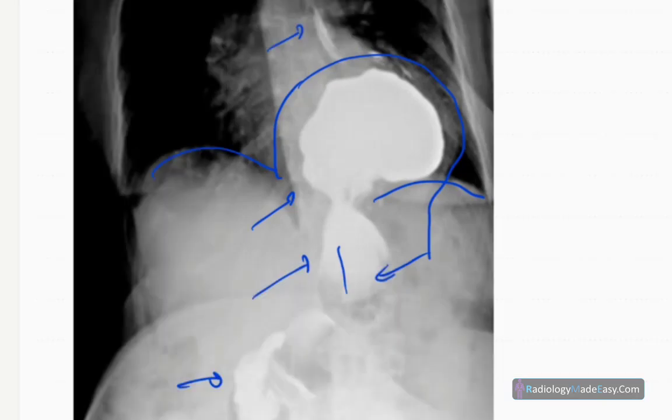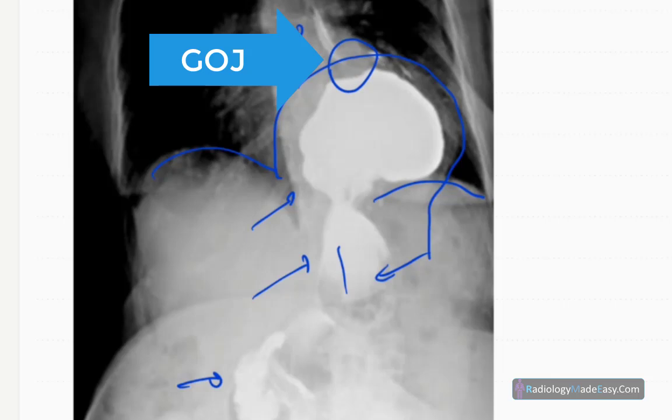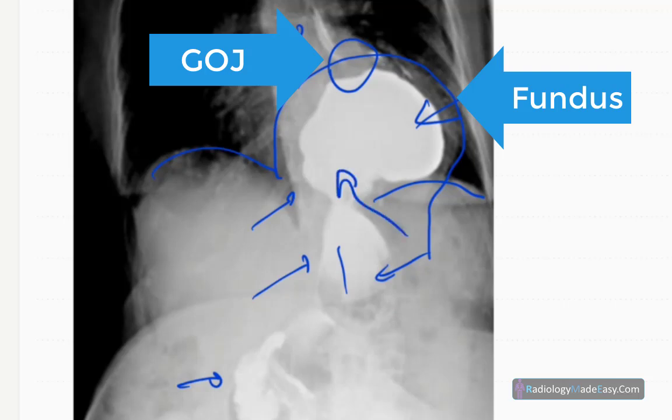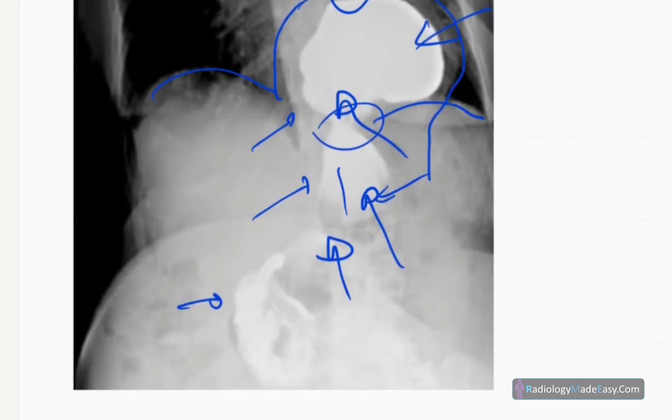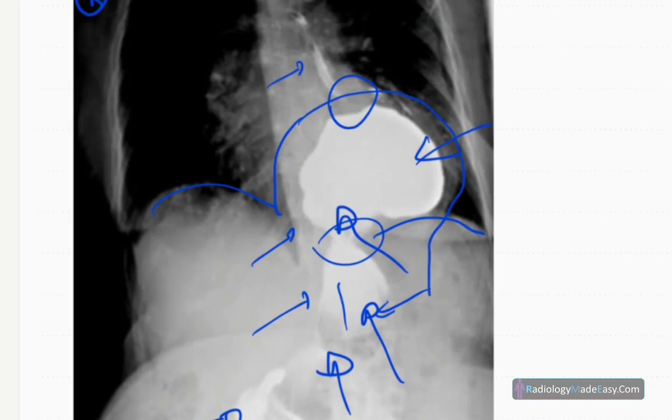This is the gastroesophageal junction. This is the fundus, and this part is the body. This is the pylorus of the stomach. This part is constricted because of the esophageal hiatus, and this is the duodenum.